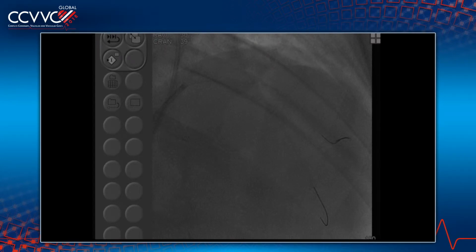Okay, are they showing the app there? Diagonal. We can show them the steps, or no? So essentially what will happen is, I agree with Ran.